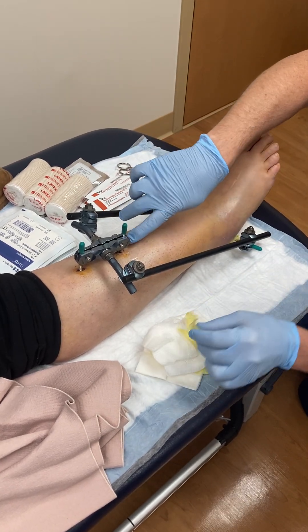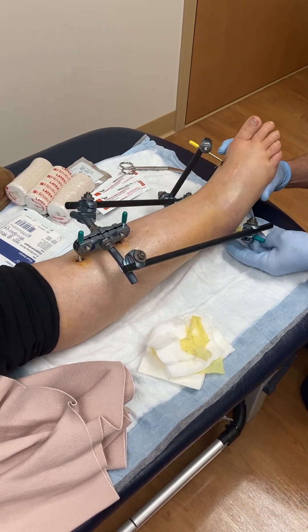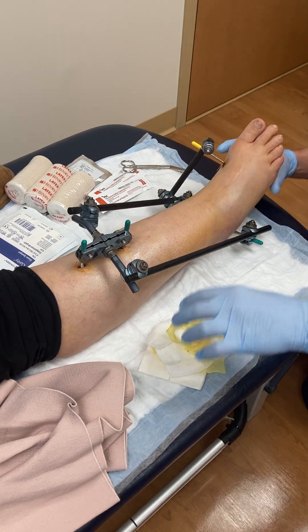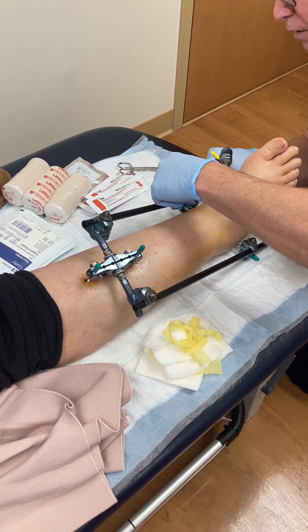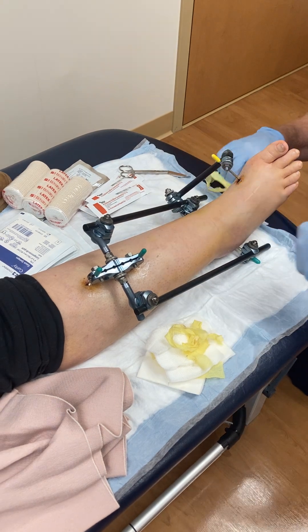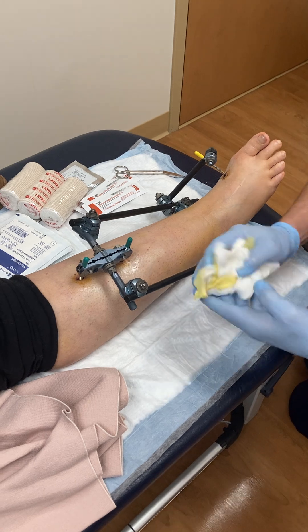As you can see, we have the pins that go into the bone, and that's what holds everything in good alignment until we're able to have the swelling go down enough to do the surgical repair. She's scheduled to have this done in a few days, but right now it's still pretty swollen because she's been in the waiting room during my busy clinic.